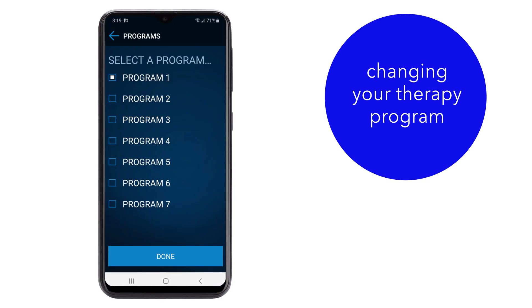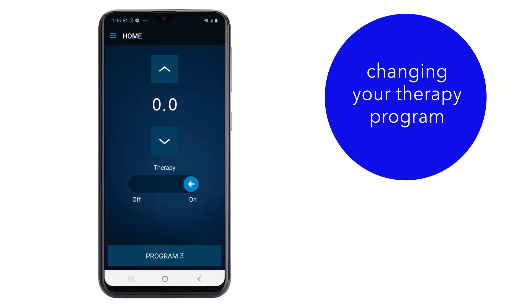A list appears. Tap the check box next to the program. Tap Done. Increase or decrease the therapy stimulation to a comfortable level. Remember to follow your doctor's instructions when making adjustments.